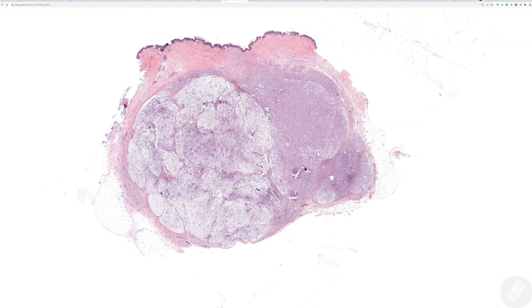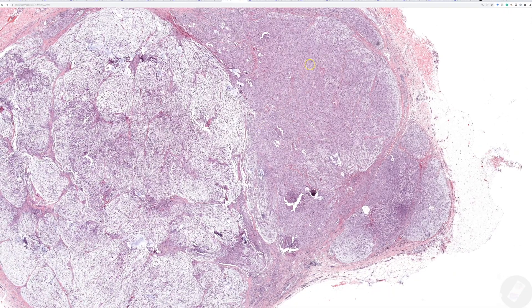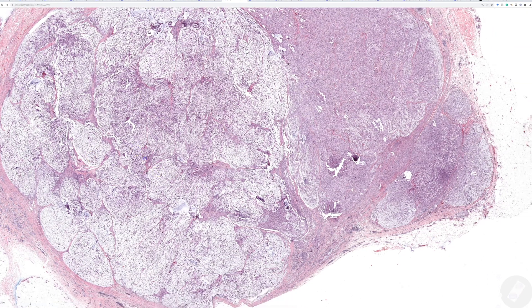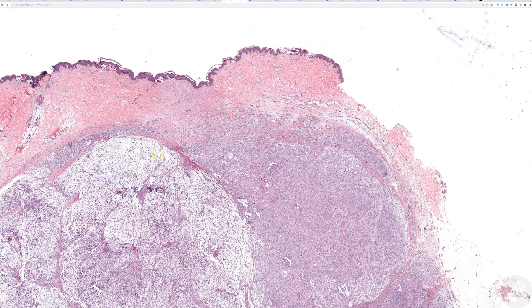If you've looked at this before, you've probably noticed we have a biphasic lesion - a solid or multinodular area on the right-hand side, and on the left a very loose myxoid lesion with patchy areas of cellularity. Let's start with the cellular area. When I see a lot going on in a slide, it's easy to go straight to the most cellular, most ugly-looking area, but I try to force myself to look away and examine the rest of the slide first.